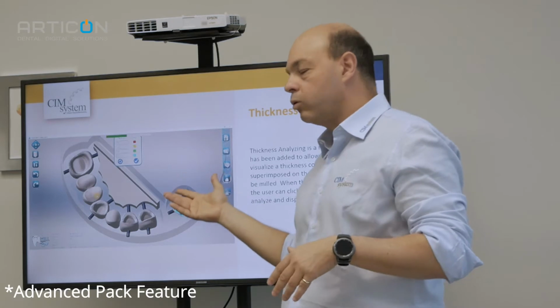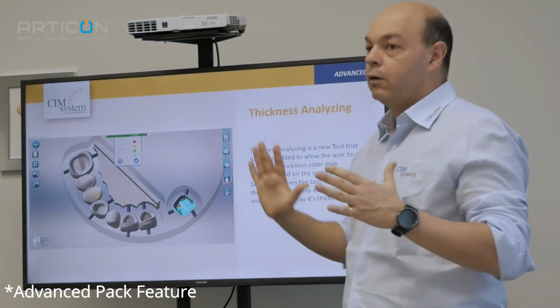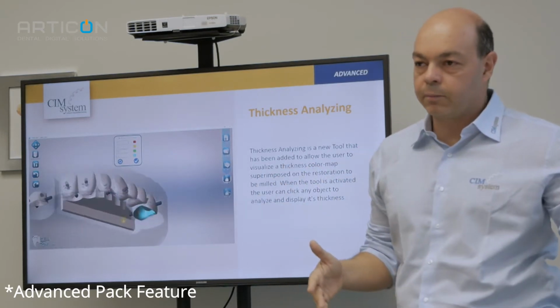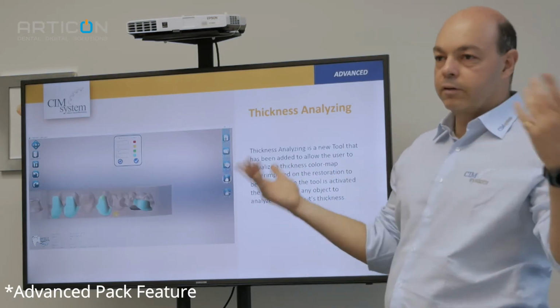But before milling, if you have the problem, you call the customer and you advise the customer. Look, at this point, for me it's dangerous. I'm milling, yes or no. If the customer says yes, if you have the problem after milling, it's not your problem. Because sometimes you mill, you send it to the customer, it breaks, and the customer blames your machine.